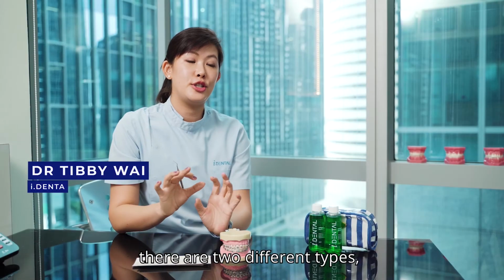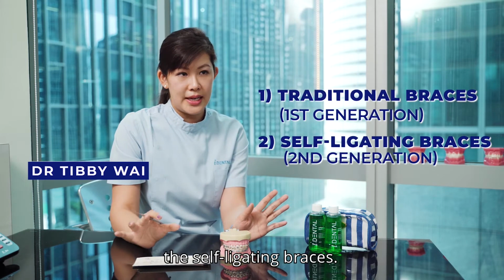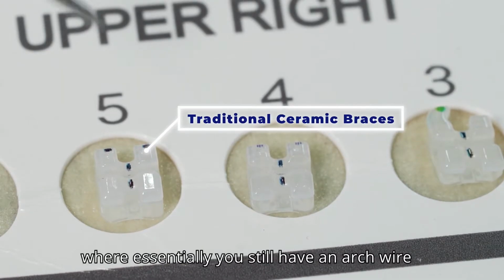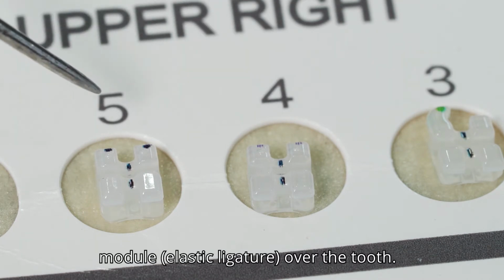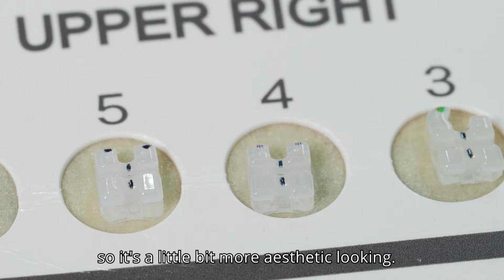Braces treatment-wise, there's two different types: the traditional braces versus the self-ligating braces. With traditional braces, there's the metal type, whereas there's also the ceramic type, where essentially you still have an arch wire and you still have a little module over the tooth, okay? But the bracket itself is tooth color, so it's a little bit more aesthetic looking.